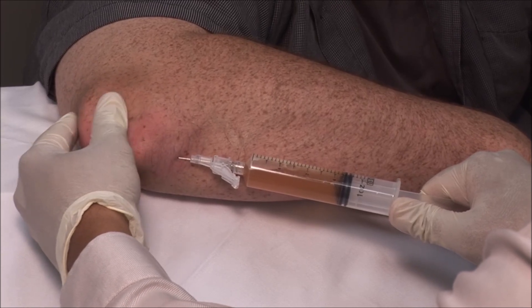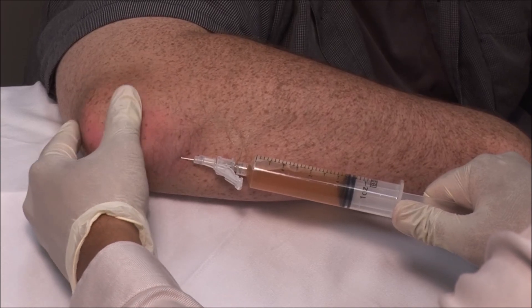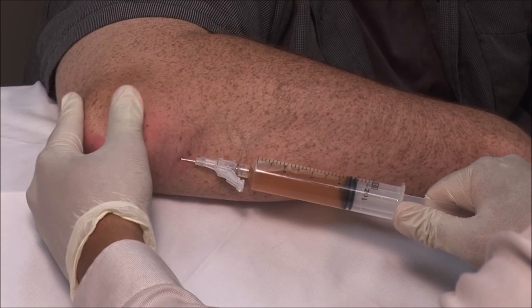You can also stabilize the bursa and apply some pressure to help the fluid to escape. I am not expecting the swelling to completely disappear as the bursa is full of tophi.